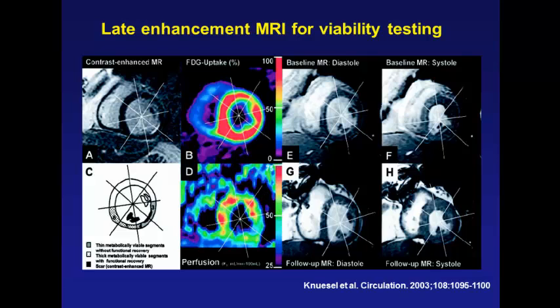Now here it's an interesting point, the comparison between MR and FDG, and I will come back to this again at the end of my talk. We did this 10 years ago. We had an MR here and a PET CT here, and we still have now 5 MRs here and 3 PET CTs here, and we will get a PET MR as well, but not because we are 100% sure that this is the future. If I would not have any PET CT and not any MR, and I could freely choose between a PET MR and a PET CT plus an MR, I would of course go for this, because then I have a PET CT and an MR. And with the PET MR, I do not know exactly whether I could do all the daily business.